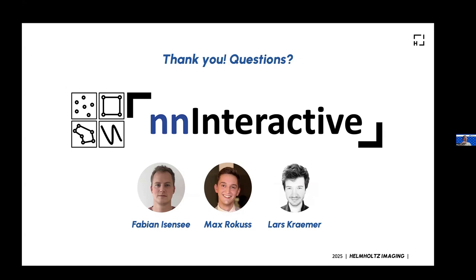But many of the transformer-based methods, of course, do late prompting, which means that you first encode the image and then put in the prompt. And this could be a thing to try. So honestly, there are various routes. nnInteractive is, in my opinion, a very good segmentation model, but of course, there might still be a lot of room to improve.